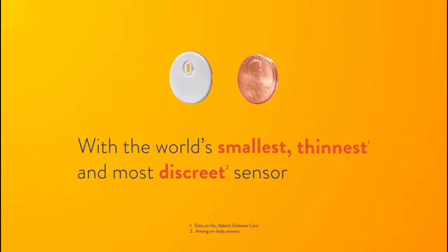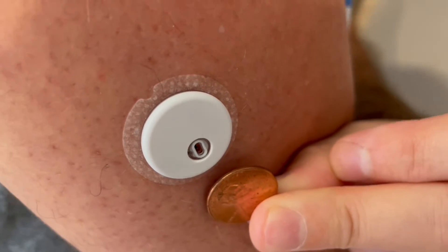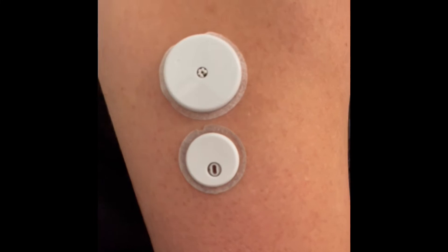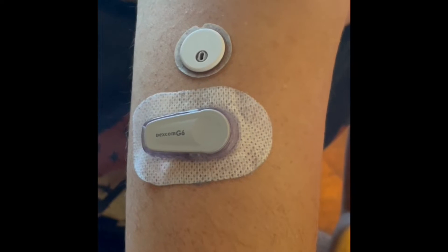Let's talk about the size, because that's one of the biggest improvements. It's one of the smallest, if not the smallest, CGM on the market. I compared it to a number of things to give a sense of scale. Freestyle Libre advertised it as the size of two pennies stacked on top of each other, which I found to be pretty accurate. I also compared it to the previous Libre model — you can see how much smaller and thinner it is — and to the Dexcom G6. It was smaller than everything I compared it to.